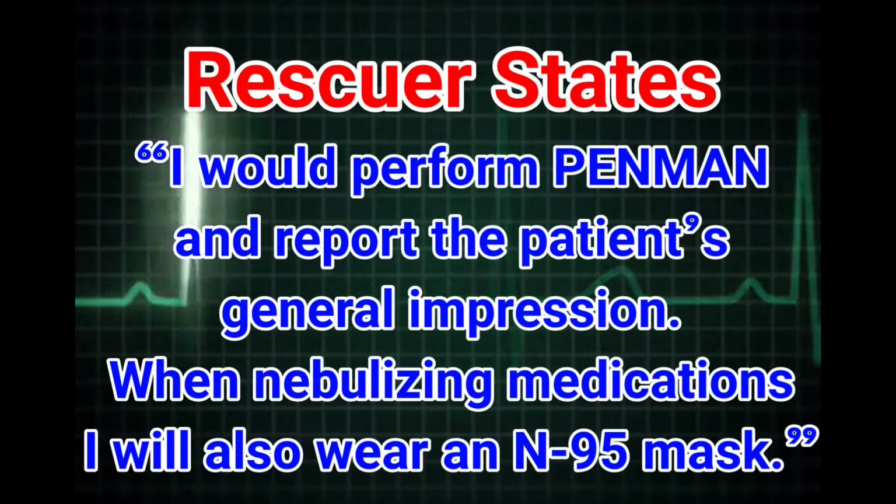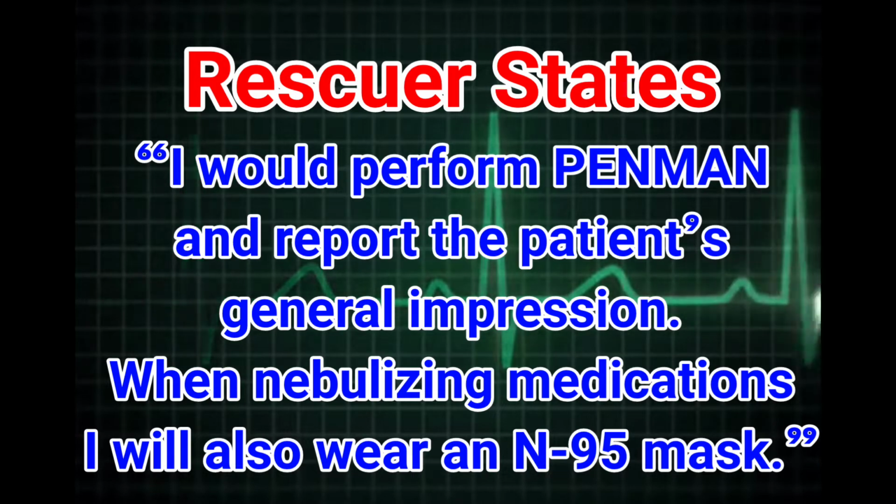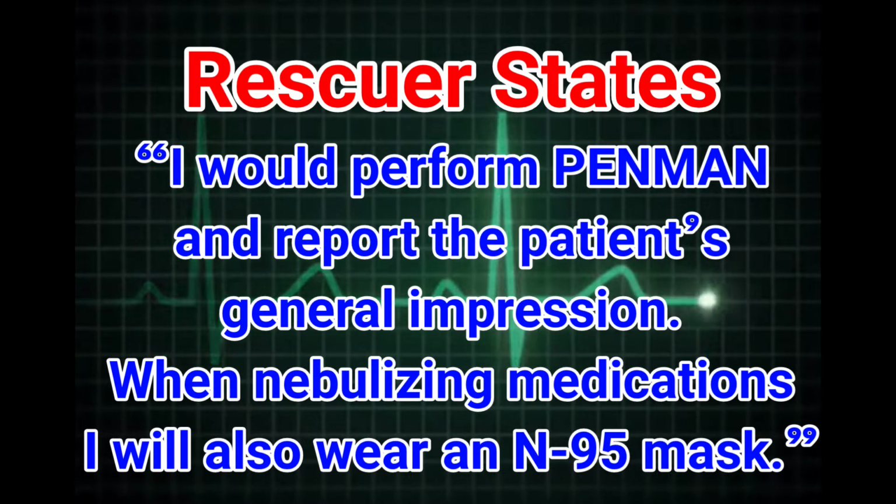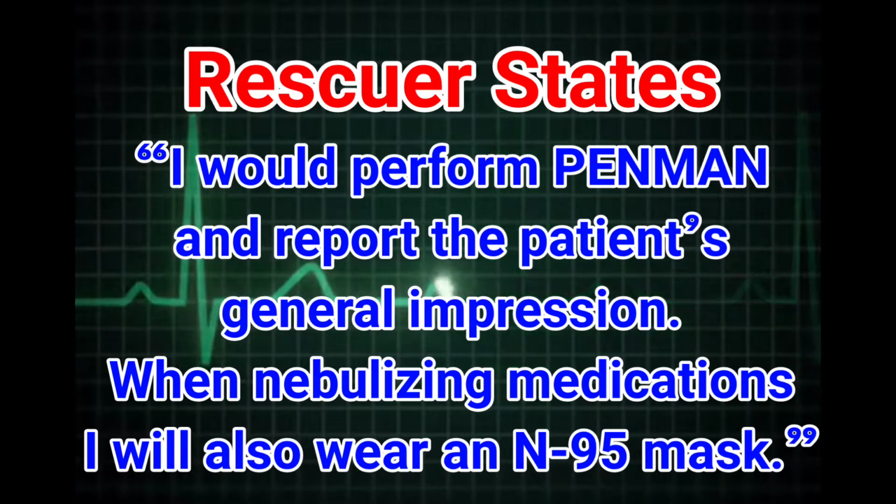Rescuer states, I would perform PENMAN and report the patient's general impression. When nebulizing medications, I will also wear an N95 mask.